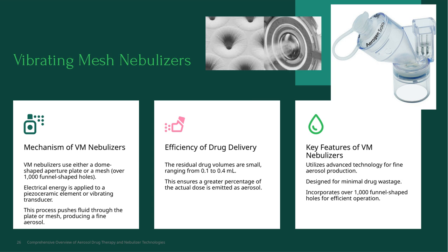One of the key advantages of VM nebulizers is their efficiency in drug delivery. The residual drug volume remaining after nebulization is quite small, typically between 0.1 and 0.4 milliliters. This means that a larger percentage of the medication is actually converted into aerosol and delivered to the patient, reducing waste.